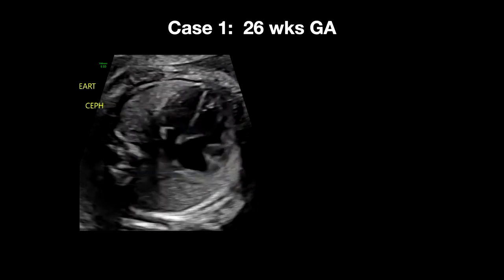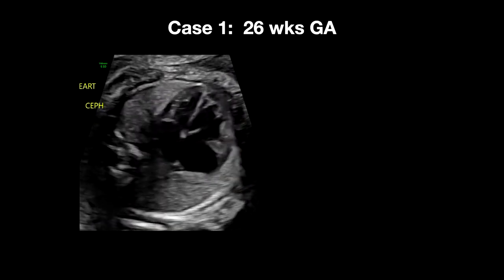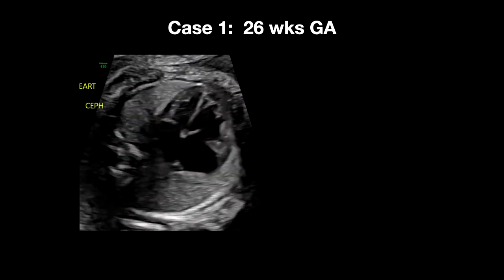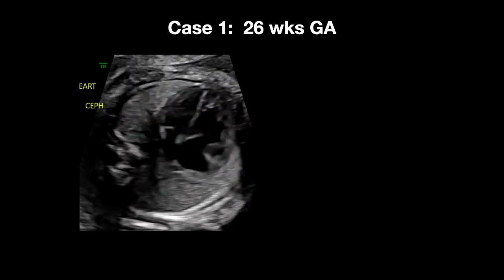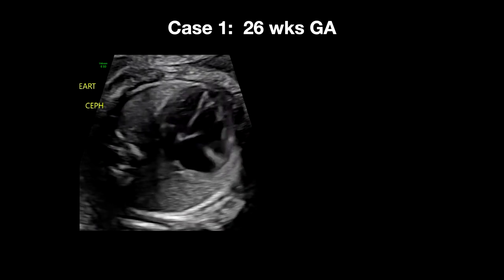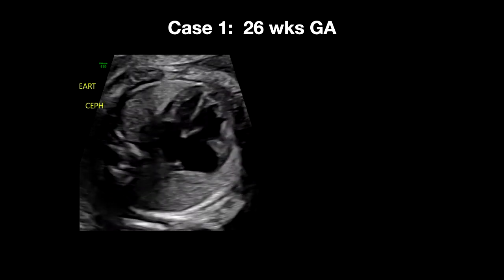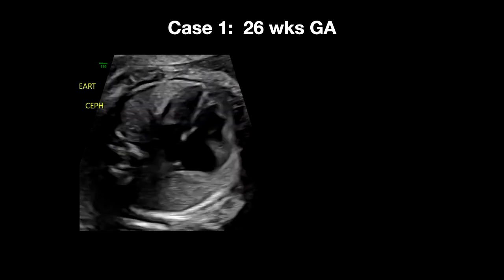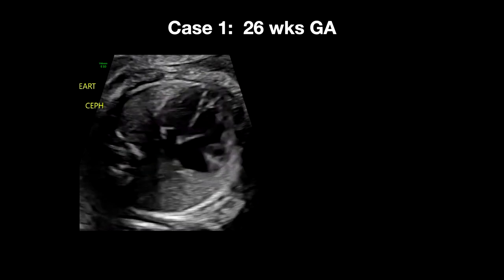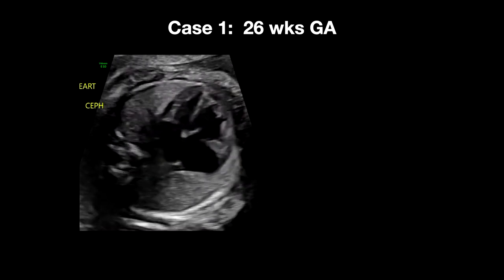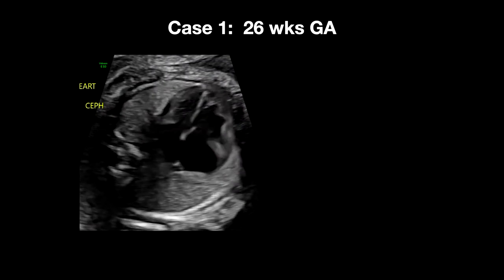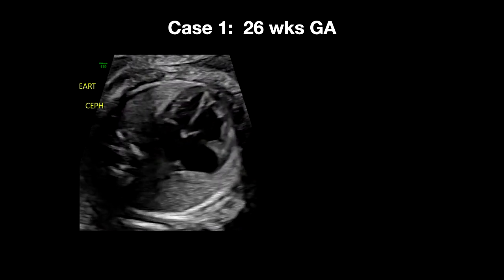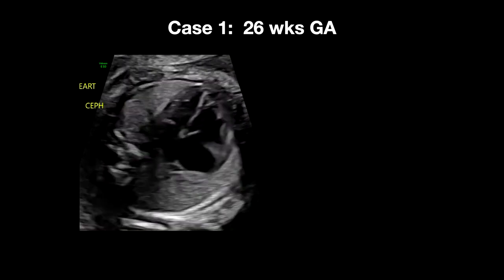Case one: at 26 weeks, a patient came in for a late anatomy scan. As you're looking at this heart, you can see that clearly — more likely a normal four-chamber view — but you start to question. Sometimes when you're scanning, it could be just your angle of insonation, how certain views look, how the right side of the heart could look big.